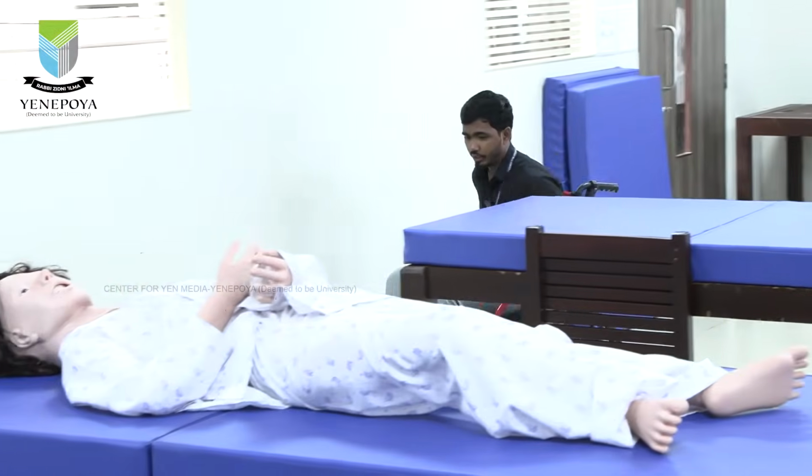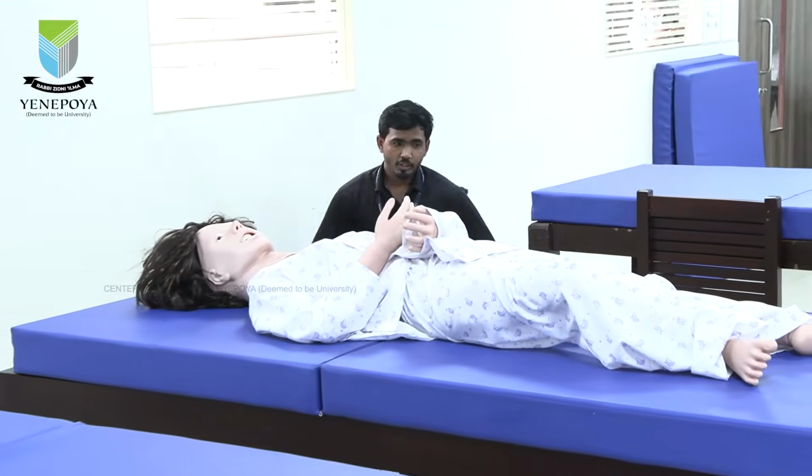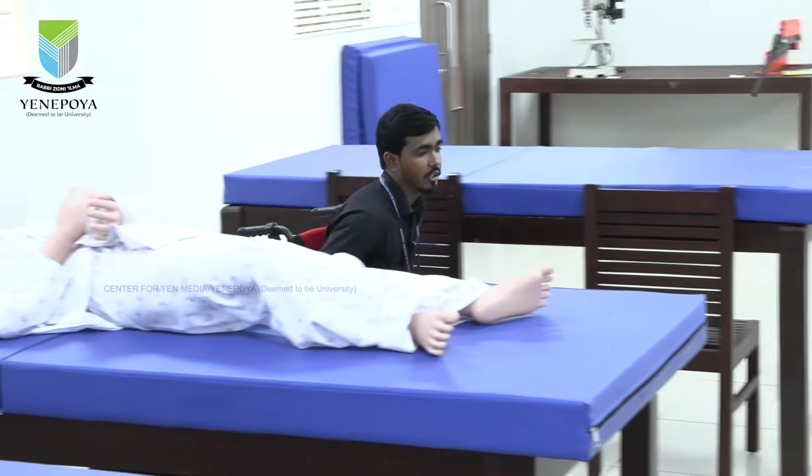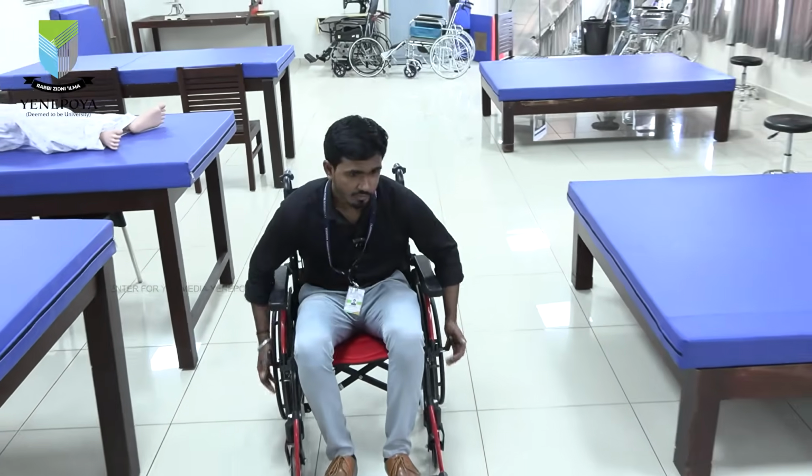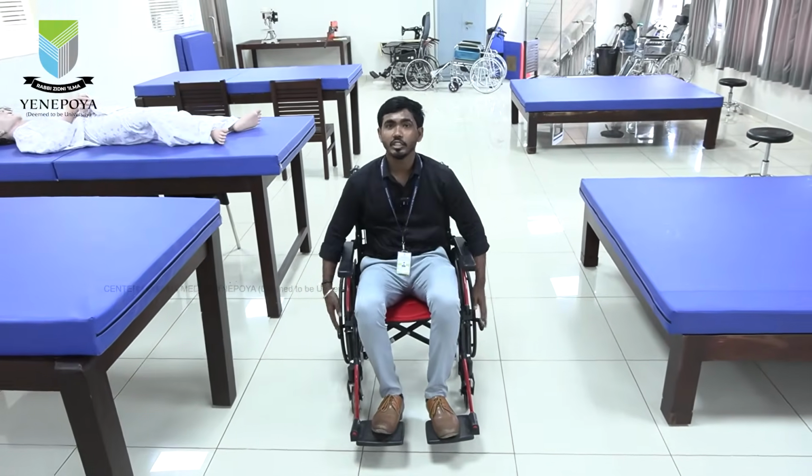We just push, we won't touch here, only using the pure wheelchair skills we have taught before with this patient. This is one of the main things we do before the person is getting discharged.